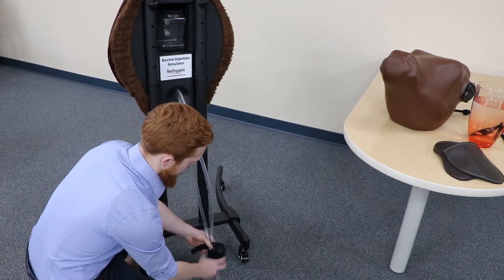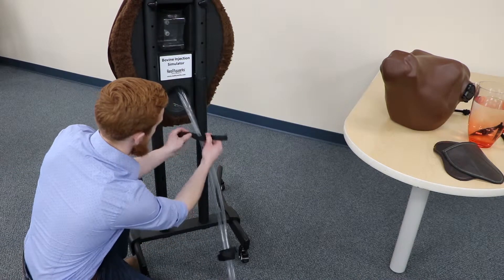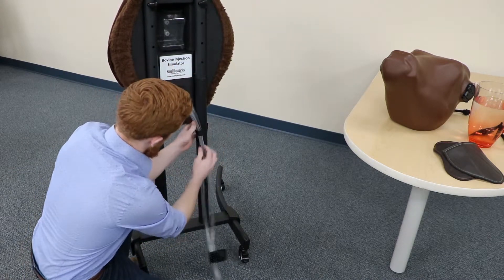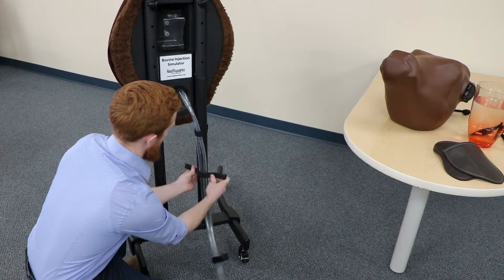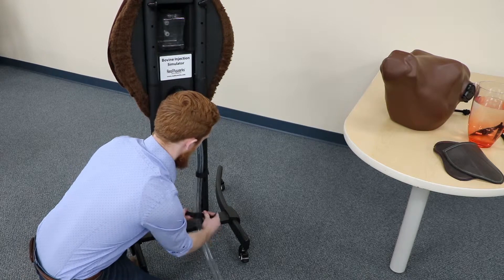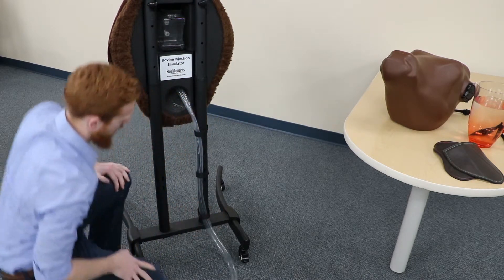There are three straps that hold these tubings to the foot pump, to the uprights of the stand. We're just going to Velcro them on so that they're securely attached, but not too snug that it pinches off the tubing.